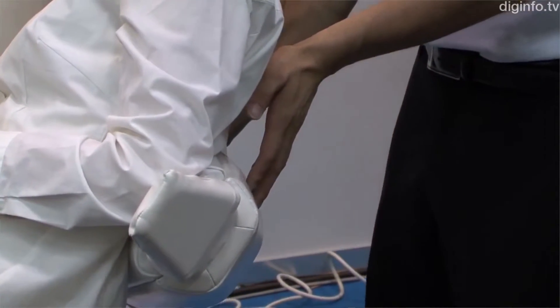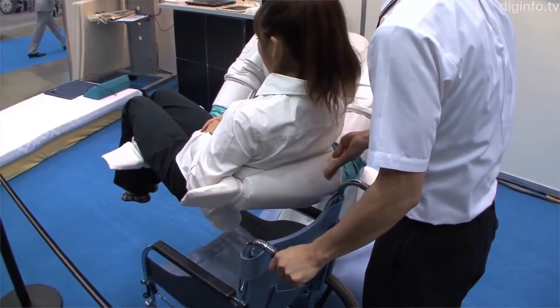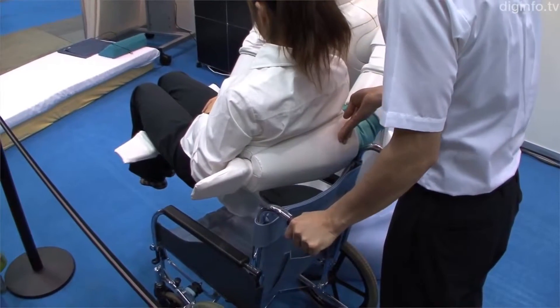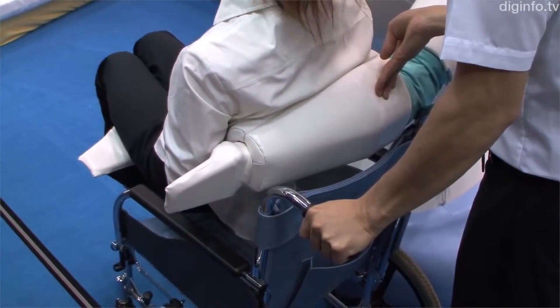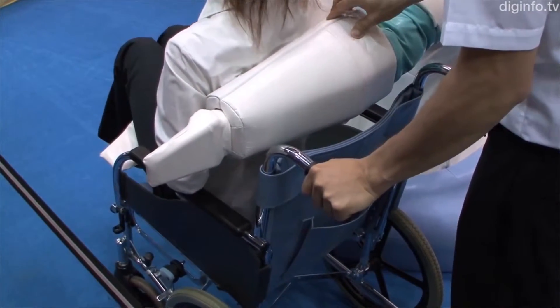Staff can control Reba's motion by directly touching its tactile sensors. Reba's makers say it is an intuitive control method because the contact position and force direction coincide with those of the desired motion. By pattern processing, Reba can detect the operator's touch even when in the process of lifting a human.